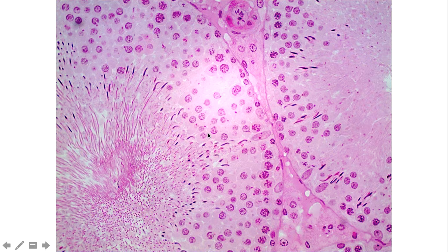And these seminiferous tubules are those tubules where sperm develop. So if we consider this one here on the left, we have this outer area. This is sort of the basal layer or the germinal layer. And along this outer area, this is where we have the least mature, the earliest of the developing spermatocytes. As they divide and go through meiosis and become more mature, they start to acquire a more typical sperm-like appearance. And so by the time you get to the lumen, you have cells that are referred to as spermatozoa.